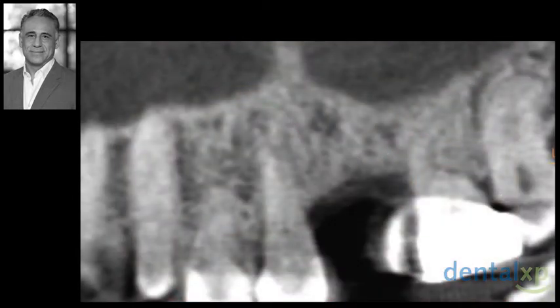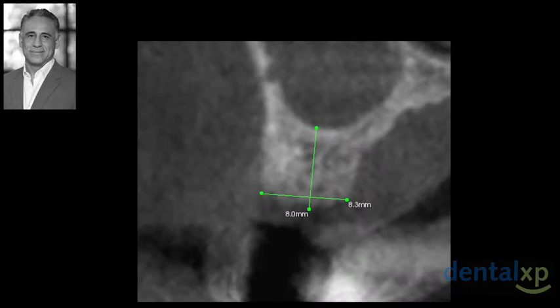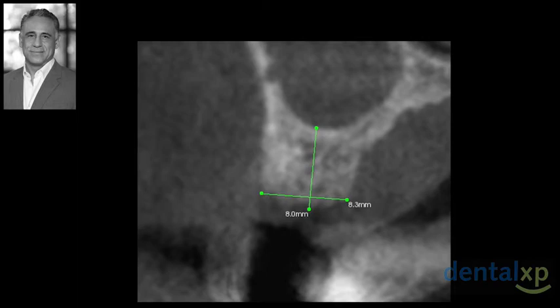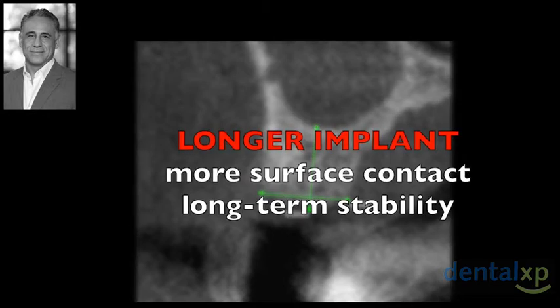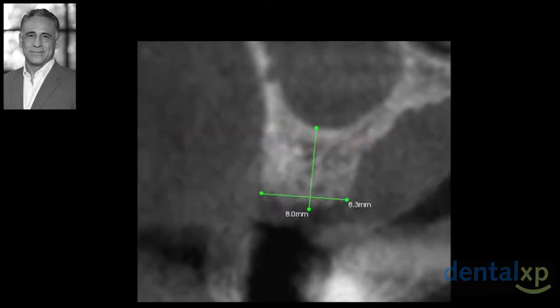Our diagnostic CBCT in this patient demonstrated 8mm of available bone height due to proximity of the sinus floor and presence of an excellent amount of bone width. While a short and wide dental implant can be placed in this site, it is certainly possible to develop the site further in order to accept a 10mm implant, which offers us more surface area contact and benefits of long-term stability. This is particularly important in the posterior maxilla, where the bone quality is often less ideal, or in patients where we anticipate greater occlusal forces.